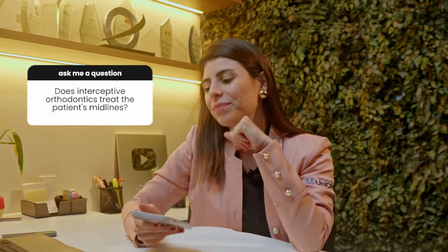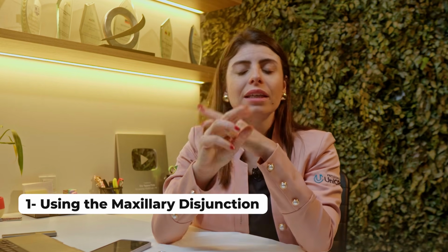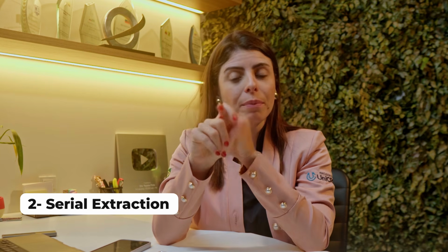And the last question: in interceptive orthodontics, do you treat the patient's midlines? And this is a good question because, of course, we do. We are concerned with treating the patient's midline, and we have a few ways to treat it in interceptive orthodontics. One way would be with the maxillary expander itself, by controlling the space closure of this expansion of the interincisal diastema using an anchorage with a button and a metal ligature.